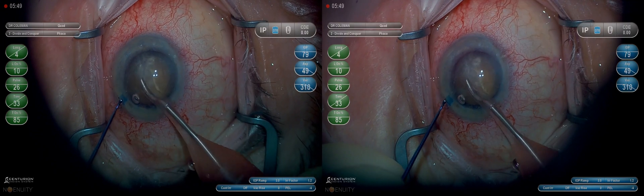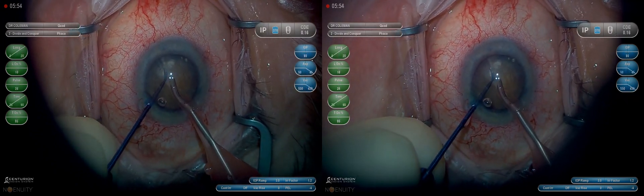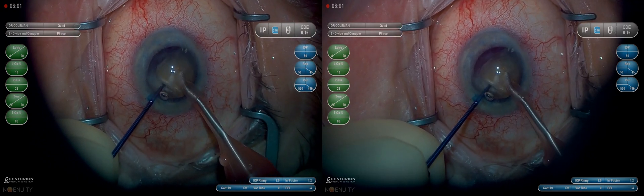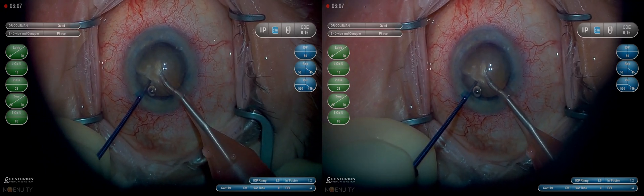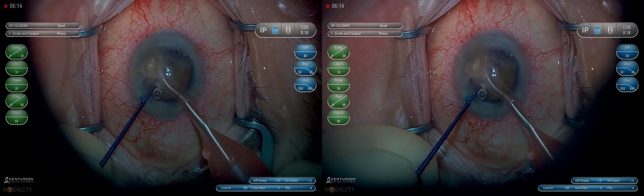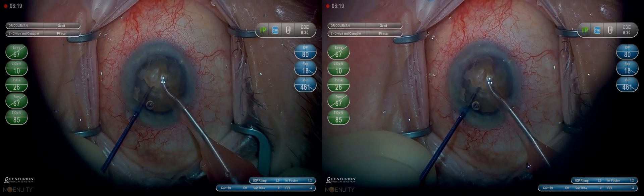Here we're in procedure two on the Centurion for a divide and conquer. I use essentially the same technique of breaking the lens into a quadrant whether I groove it with the phaco or whether I crack it in half with the MyLoop. You can see we break off what is almost a perfect quarter. I believe this is the most efficient way I have found to remove the nucleus in a real consistent way, whether it's a dense lens or whether it's a very soft lens.